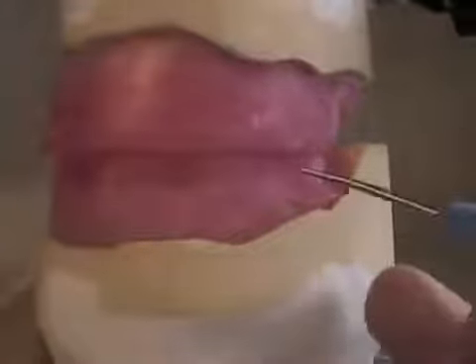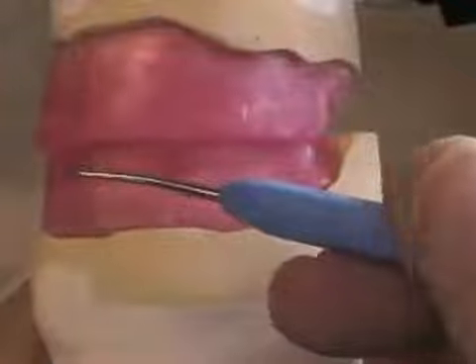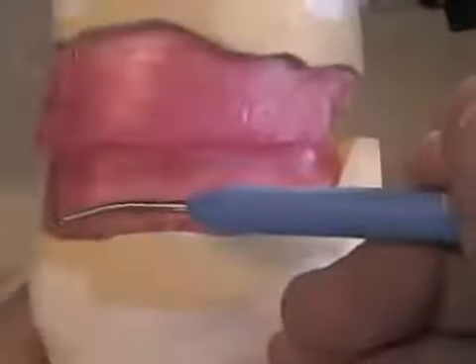When you are finished adjusting your rims intraorally, you should see that there is nice even contact all the way around the rim. You should also make sure that you have about 2 millimeters of overjet all the way around the rim. If there is insufficient overjet, the patient may bite their cheeks.